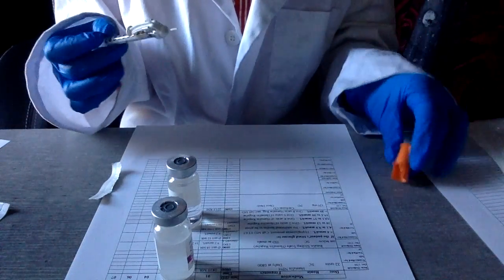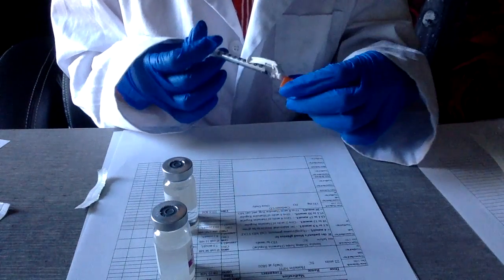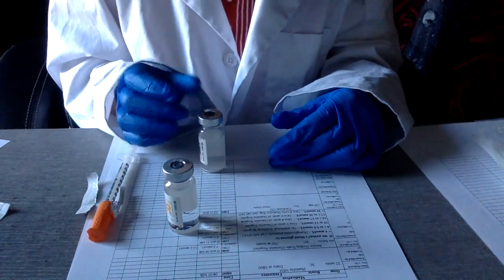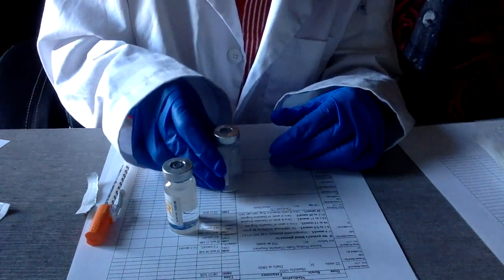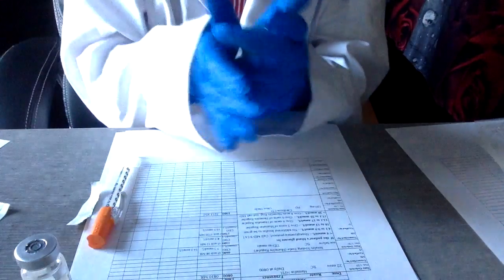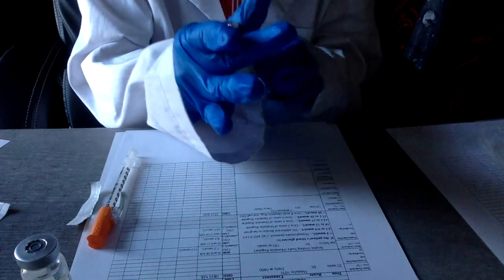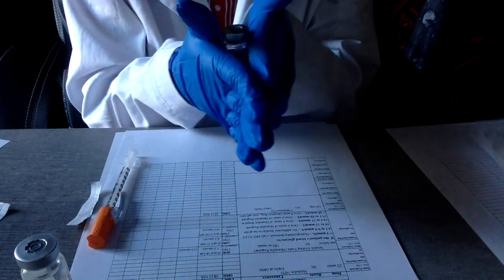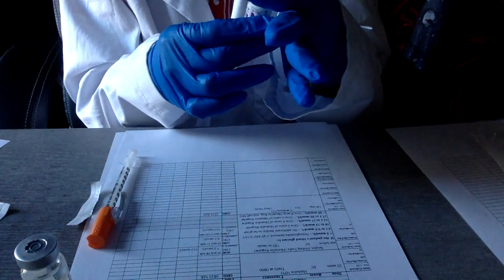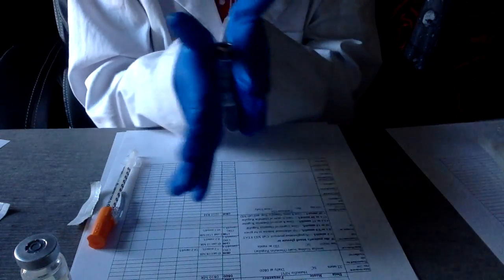I'd remove the cap. And I also have to make sure that the Humulin N is always mixed well. To do that, you just take the vial and slowly roll it in the palms of your hand. Because if you don't do that, you won't get an accurate amount of Humulin N into the injection for the patient. So you just have to make sure it's mixed evenly, and you can't shake it, otherwise that causes air bubbles.